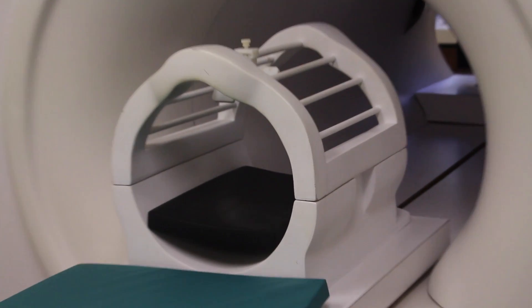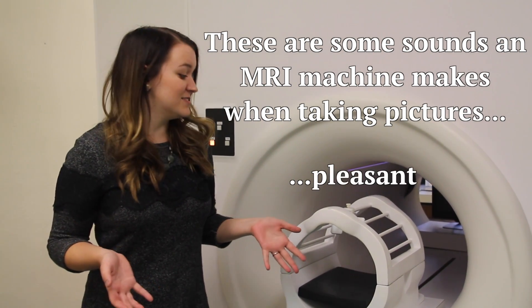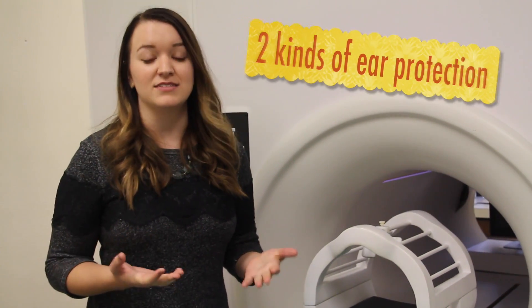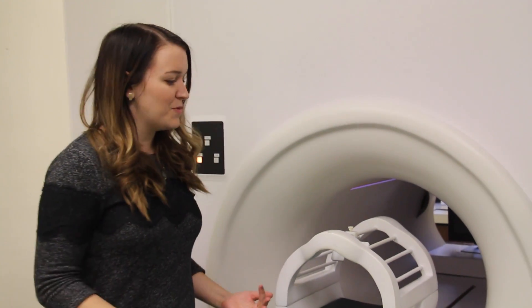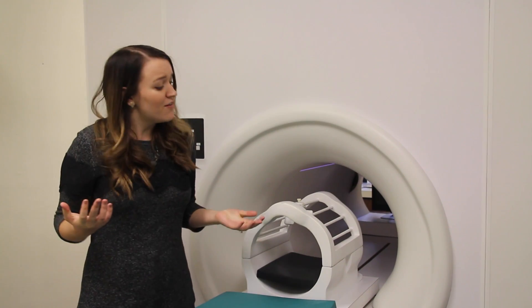MRI has been used to study children's brains for many years, but more recently researchers have begun to use MRI to study the brains of infants as well. One of the really difficult things about MRI is it's very noisy and we need infants and anyone to stay really still. Parents are given sounds of MRIs to play at home to get infants used to it. When infants come into the lab, we give them two kinds of ear protection — little earplugs and then big headphones — to protect their hearing. We get them to fall asleep and take beautiful pictures of their brain while they're asleep. We always have someone in the room at all times who can tell when the baby's awake or kicking, and if they ever wake up we just bring them out.